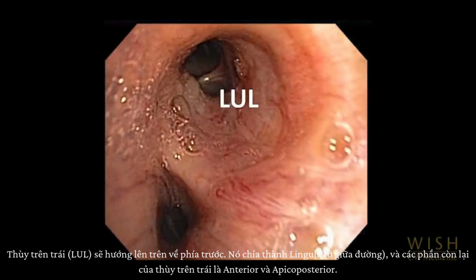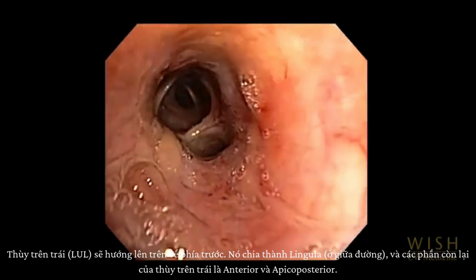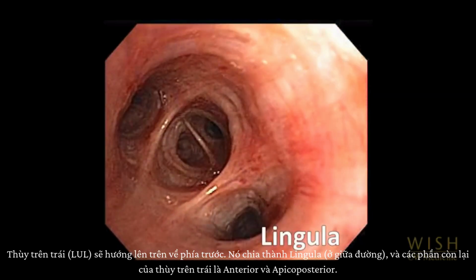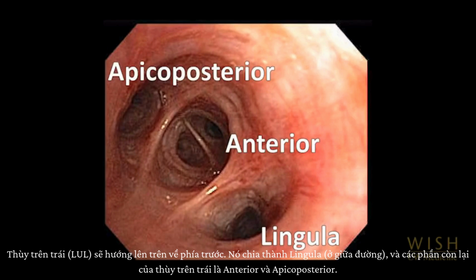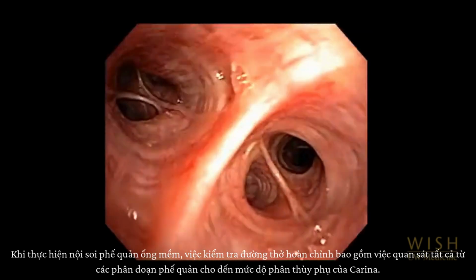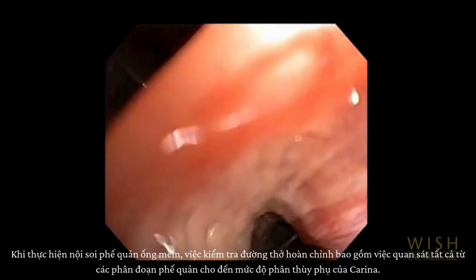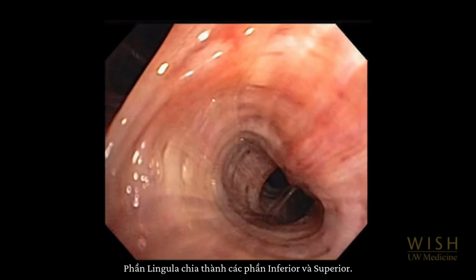The left upper lobe bronchus takes off anterolaterally. It divides into the lingula, which is medial, and the remaining left upper lobe segments, which are anterior and apico-posterior. When performing flexible bronchoscopy, a complete airway inspection involves observing all segmental bronchi to the level of the subsegmental carina. The lingula divides into inferior and superior segments.